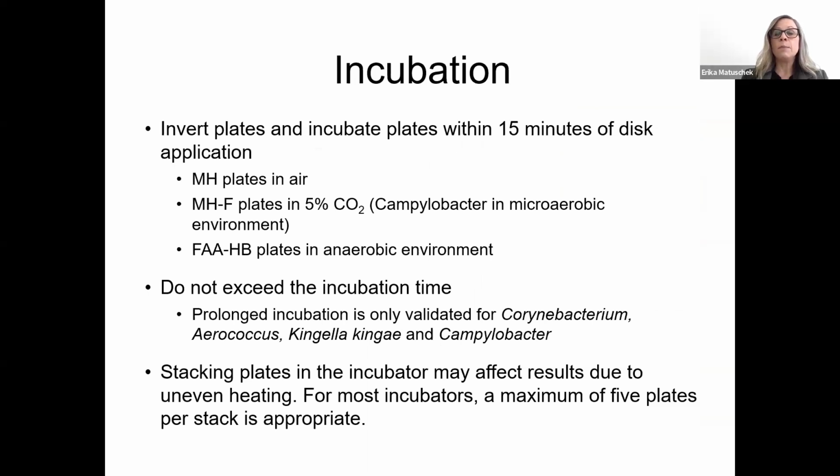The incubation time is, unless otherwise stated, 16 to 20 hours, and it is important not to prolong the incubation time. For some organisms or species that do not grow very well, we have validated a prolonged incubation time, but that is only done for Corynebacteria, Aerococcus, Kingella kingae, and also for Campylobacter.